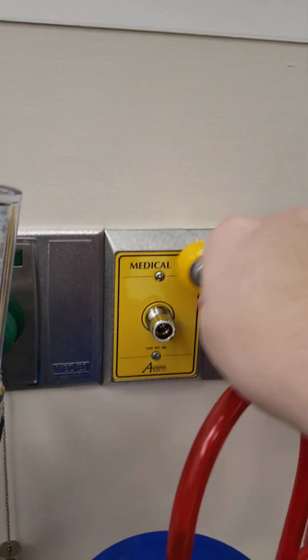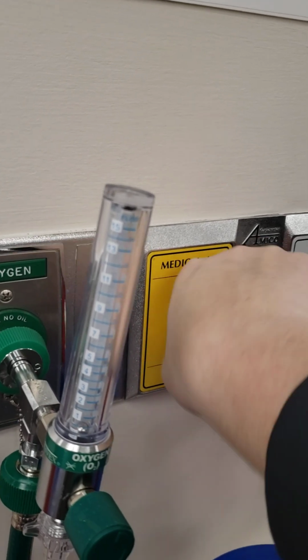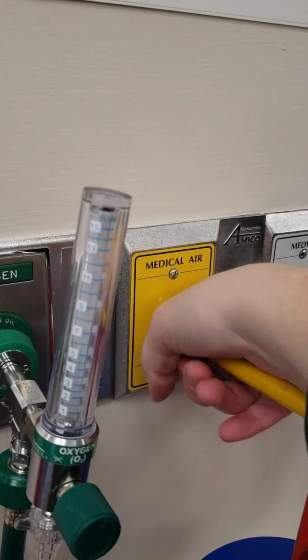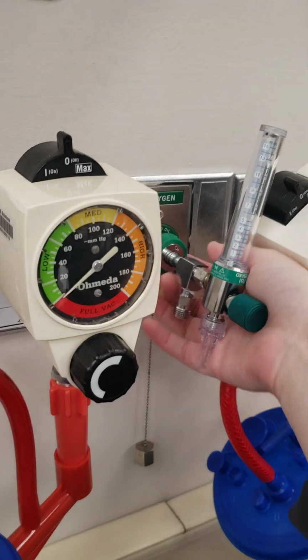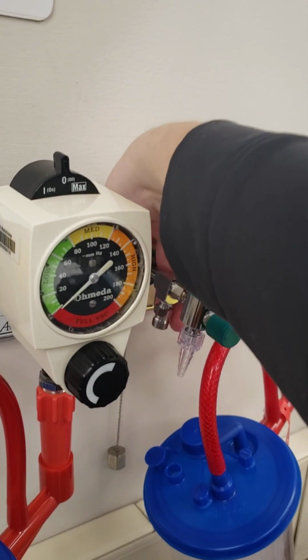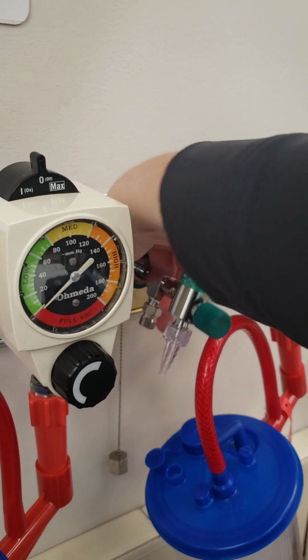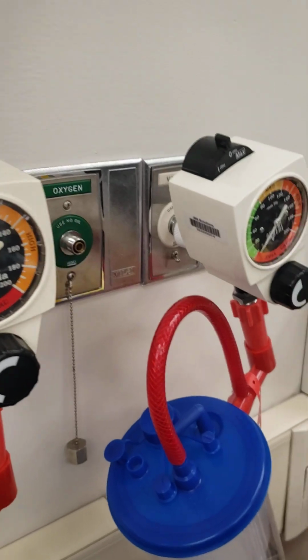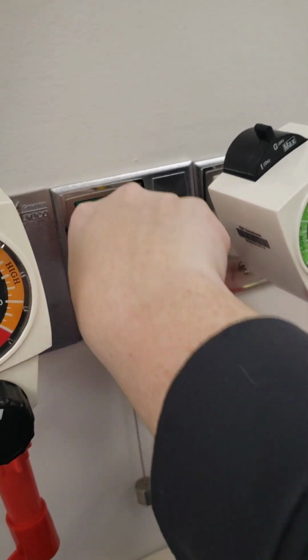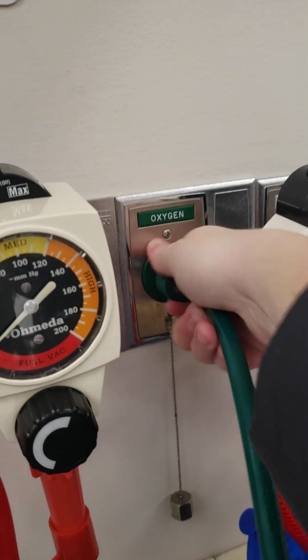This is really easy to do. You push it in and you twist. It's going to squeal at you until it's in and it's sealed all the way, and you probably will need both the oxygen and the medical air on for it to stop squealing. And now this Panda Warmer is hooked up and we can start to use it.